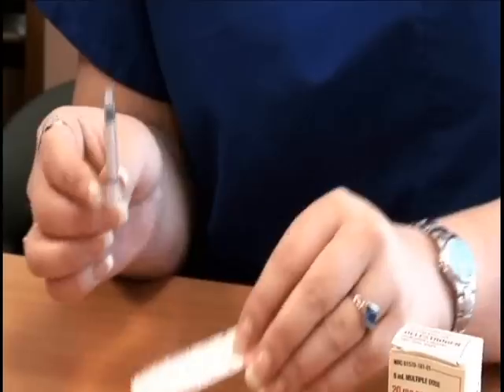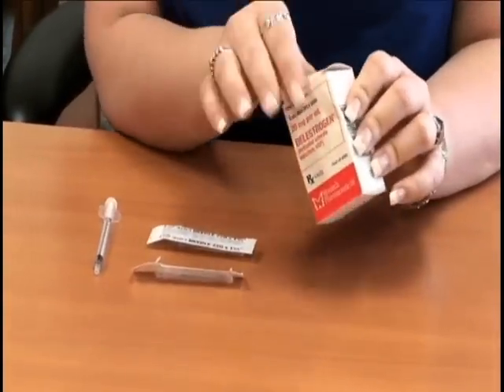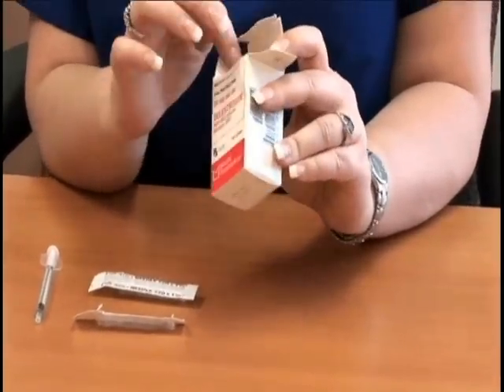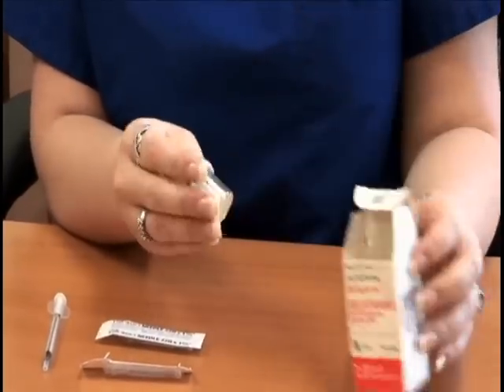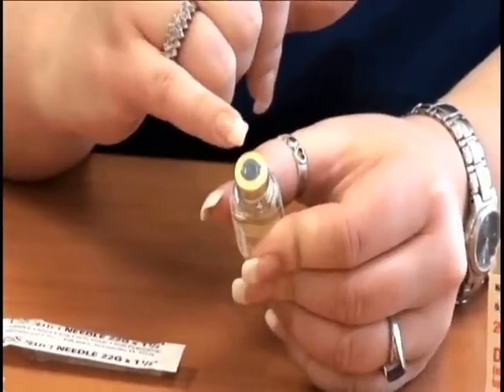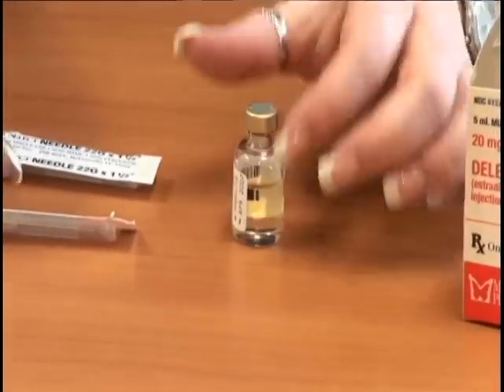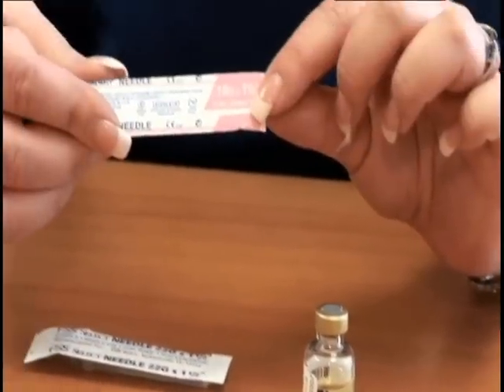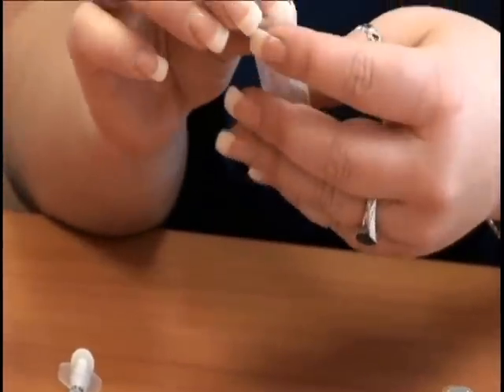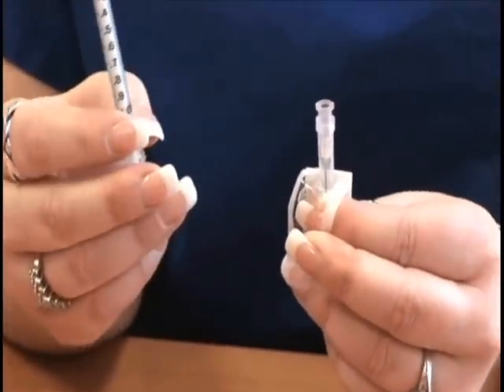The first thing you want to do is remove the medication from the box. It will come with a metal cap on the top, and you will need to remove that metal cap. Then take and open up the 18-gauge 1½-inch needle and apply it to your 1 ml syringe.